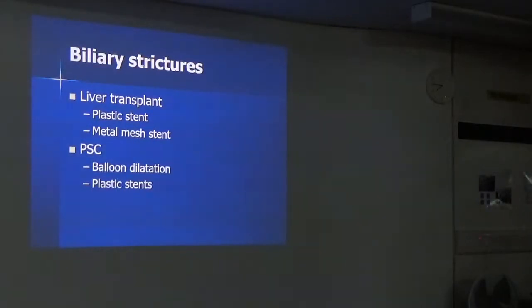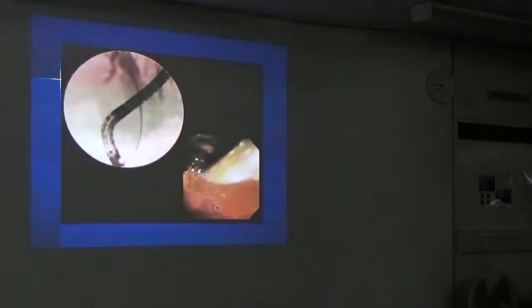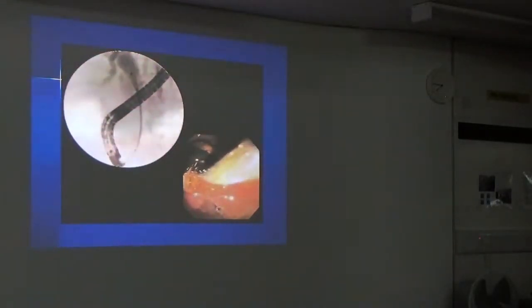And for patients with PSC, in certain situations, the strictures can be treated with putting a device up and inflating a balloon to open up the stricture, or again, stents can be put in. So this is, I'll just stop this and show you.